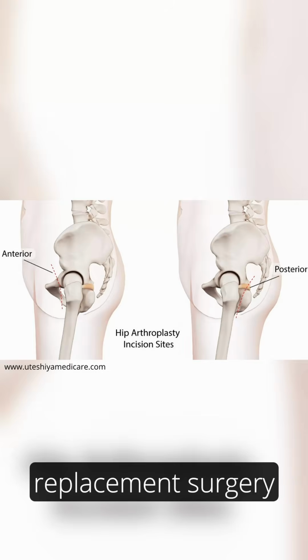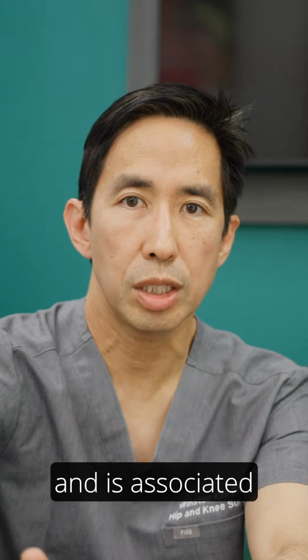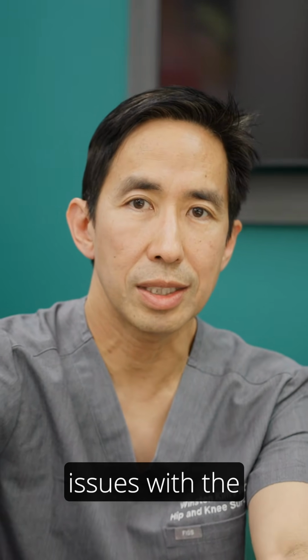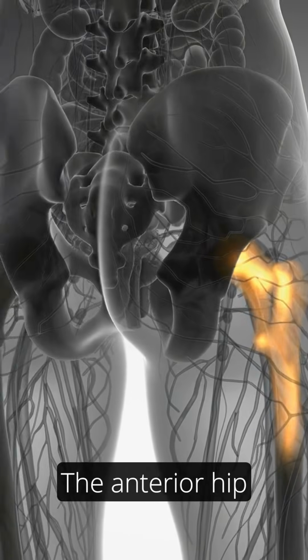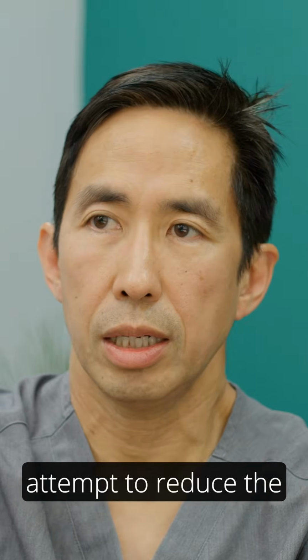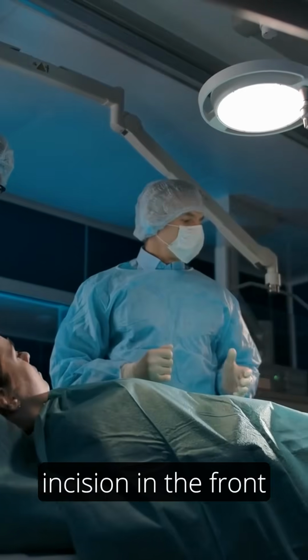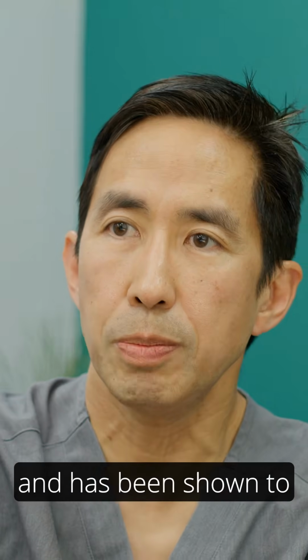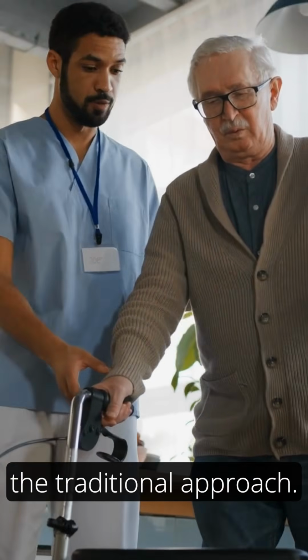The way a hip replacement surgery is performed traditionally is using the posterior approach and is associated with specific complications such as dislocation and issues with the sciatic nerve, causing numbness and sometimes even weakness down the leg. The anterior hip replacement has been developed in an attempt to reduce the complications associated with the posterior approach. It involves an incision in the front of the hip, splits the muscles instead of dividing the muscles, and has been shown to be associated with a much quicker recovery compared to the traditional approach.